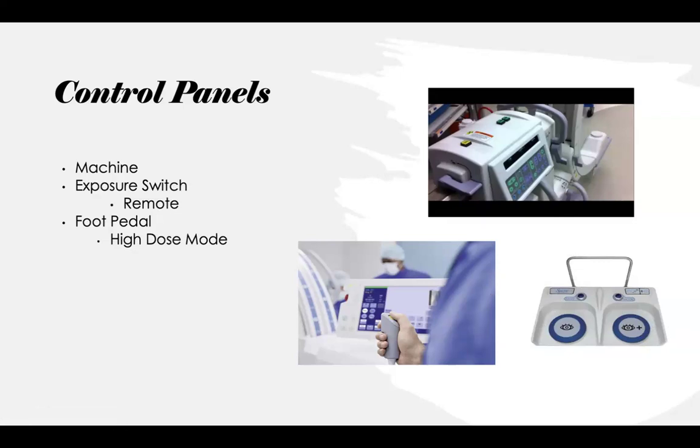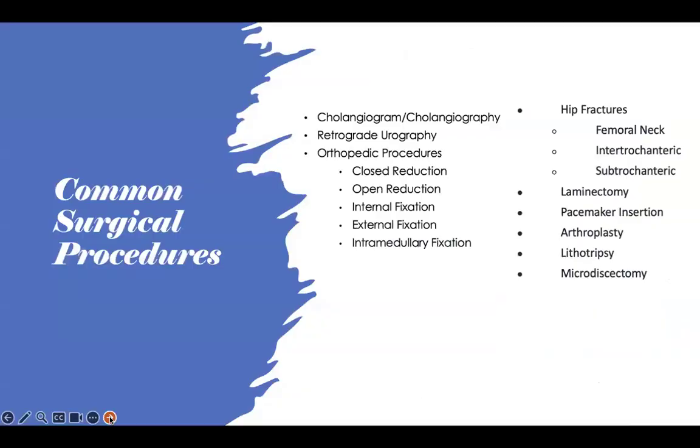Sometimes, and it just depends on cases, you'll have a higher dose when you use the foot pedal or you let the surgeon use the foot pedal. And within reason, because if they're doing a vascular case or if they're doing a neuro case, they may need to use that live picture a little bit longer than if it was an ortho case.